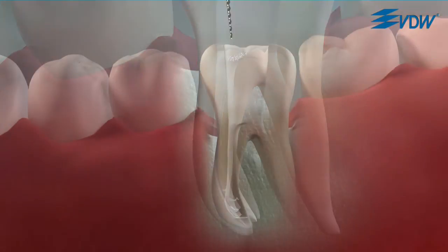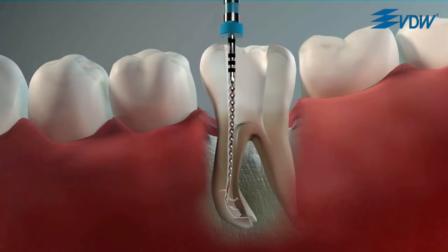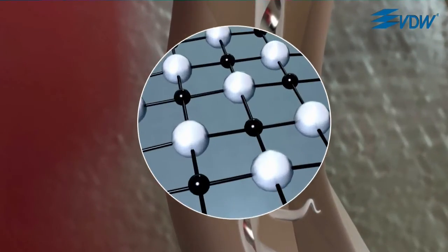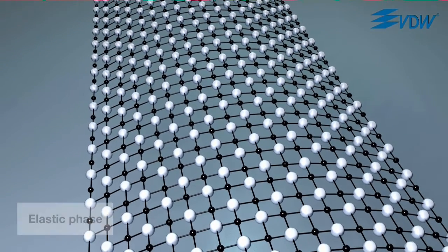The blocking of the instrument in the canal. So what exactly happens to an instrument in continuous rotary movement when it blocks in the canal? It is subjected to torsional load, which causes structural changes in the metal. These changes can be reversible or irreversible, depending on how large the angle of rotation of the instrument is.